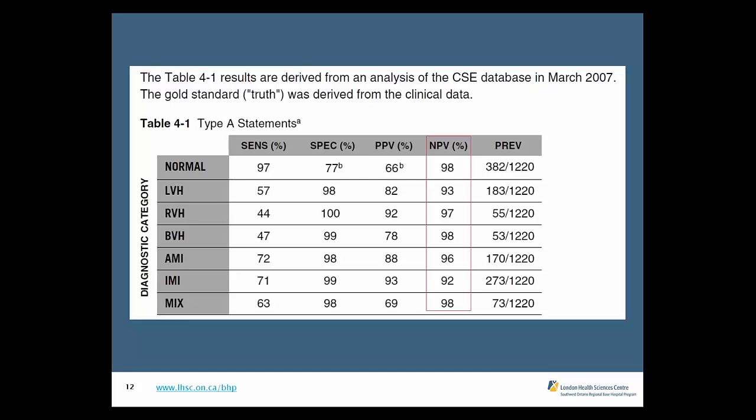Versus the patient who is 21 years old, an athlete, who has been lifting weights and developed some chest pain. It's maybe an atypical kind of chest pain, but there's enough suspicion that you do a 12-lead ECG, and there is some ST elevation on there. And for whatever reason, the computer algorithm says there's ST elevation. Then you, as the paramedic, look at this, know the patient in front of you, and say, well, yeah, there is ST elevation here, but I don't see any reciprocal depressions, and I know that most MIs are going to have reciprocal depression. In keeping with this, this is what's known as a false positive.